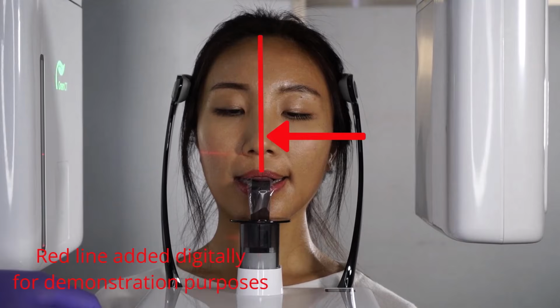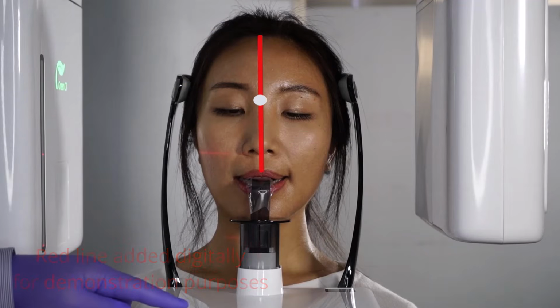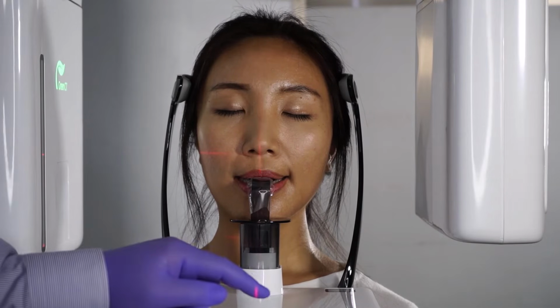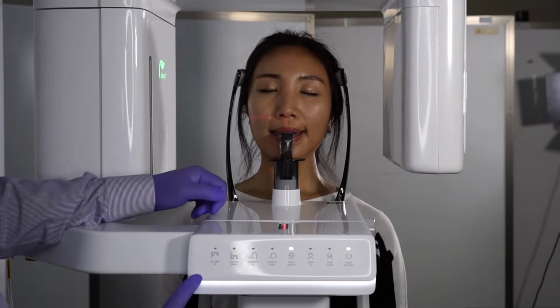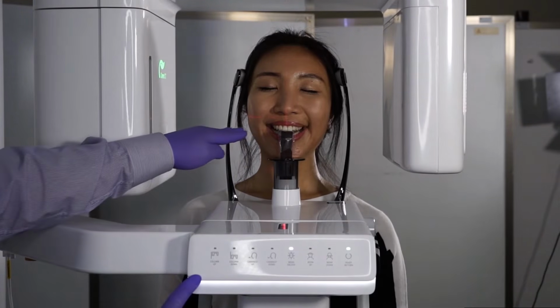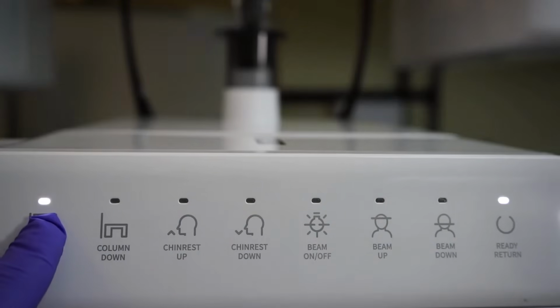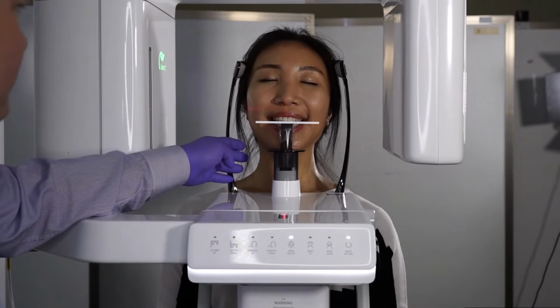Next, we are going to line up the mid-sagittal light, which runs through two anatomical points between the eyes and the philtrum. Manually adjust the patient's head to conform to the line as necessary. Once we identify the mid-sagittal line position, we want to ensure the patient's upper arch is parallel with the floor. We want the occlusion as flat as possible for the CBCT. In this example, I am pushing the column up button to adjust the patient's head to position.